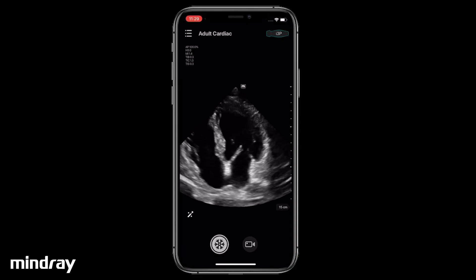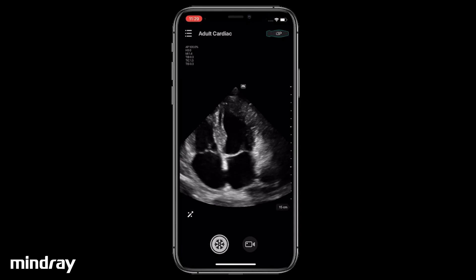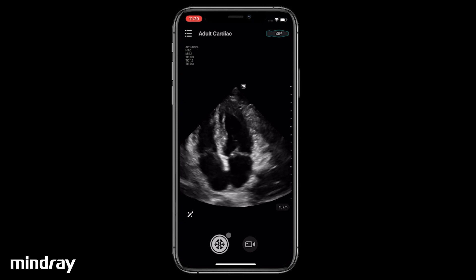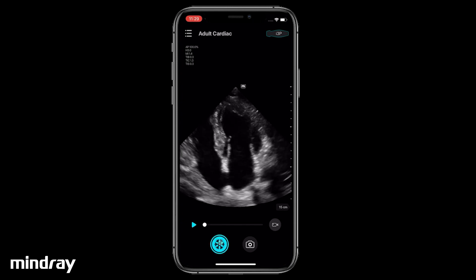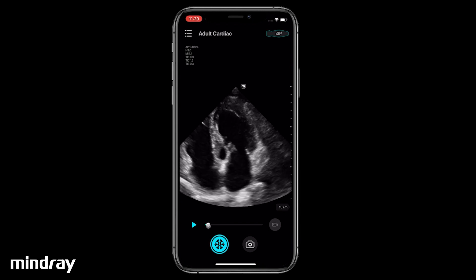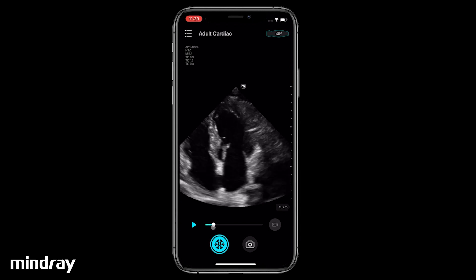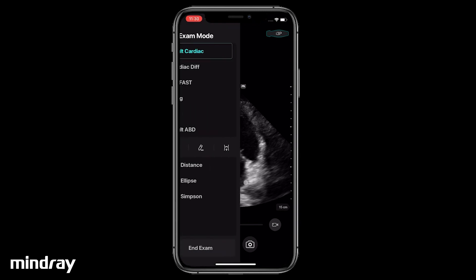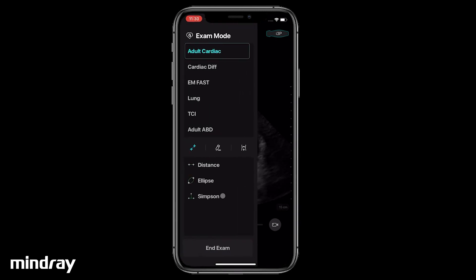Scan the apical four-chamber view and freeze. Drag the progress bar and locate the frame showing the end diastole. Swipe the screen from the left edge to the right to display the measure menu. Tap Simpson.